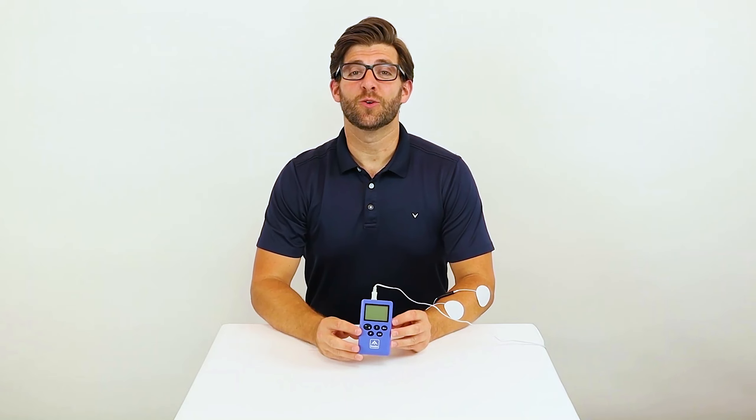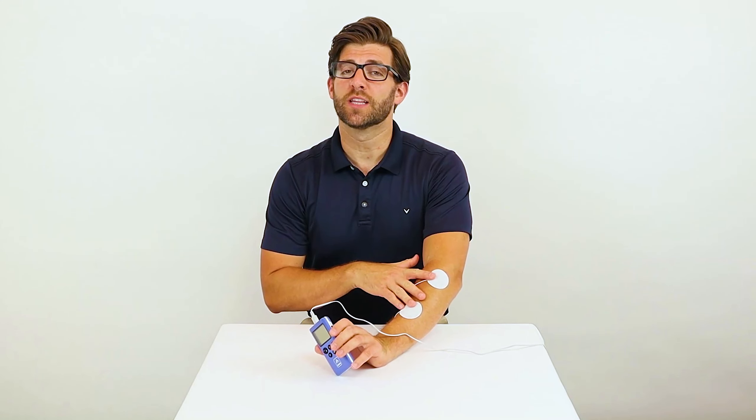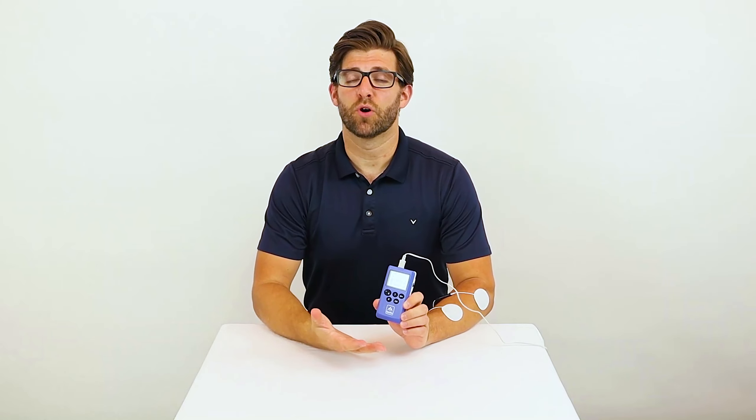To begin using your Sable Stim Pro, first place the Sabotrodes on the muscles that you would like to receive stimulation. Next, locate the on-off button on the right side of the unit and switch it to on, listening for a beep. Now the Sable Stim Pro is on.